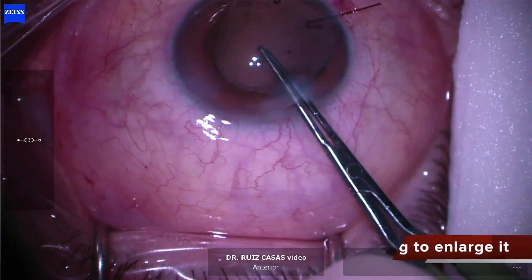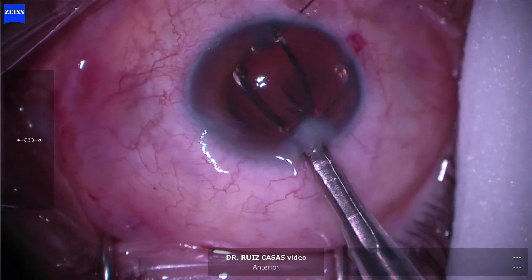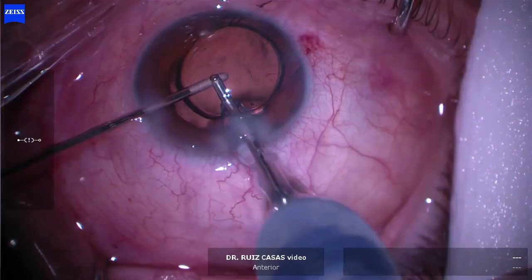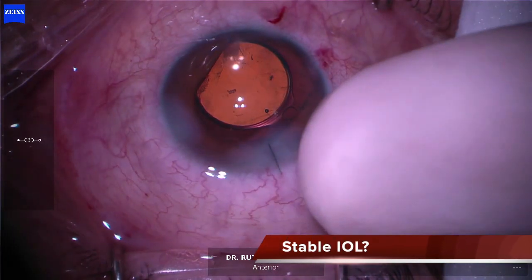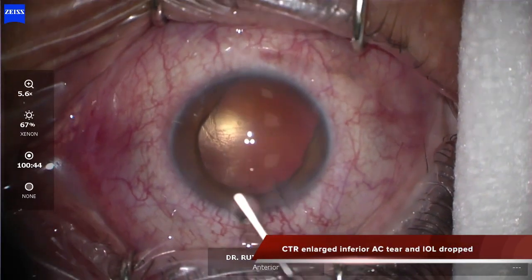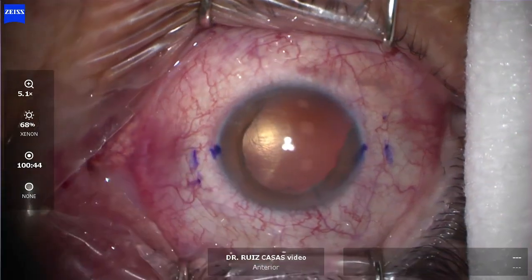Now I'm trying to enlarge the capsular rhexis, but with this movement I just lost the capsular rhexis. I cut it and implanted the lens into the capsular bag remnants because the anterior capsule was opened inferiorly. During the removal of the viscoelastic, you can see the movement of the capsular remnants — I thought it was stable, but it was not stable because of the stretching of the CTR.